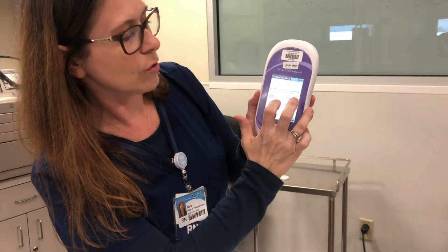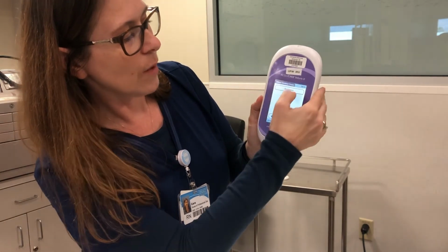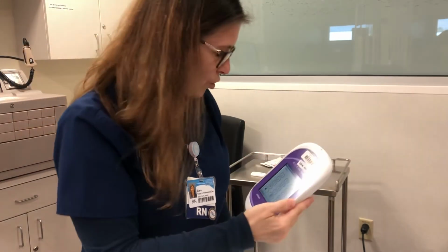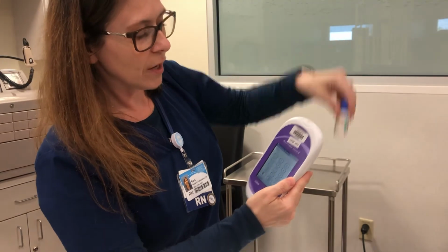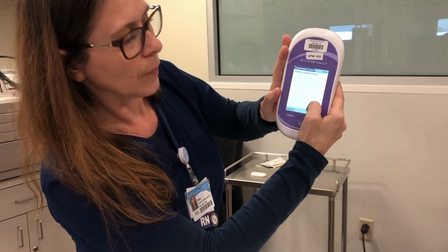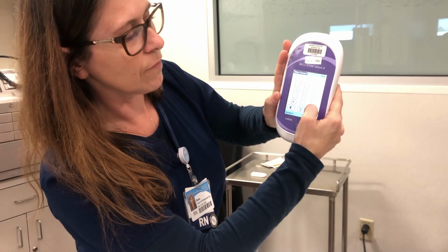So other control tests, pregnancy again, but this time we're going to enter negative liquid controls. So now I'm checking a level 1, and that's 73841. Today is 5/6. It's 1643.